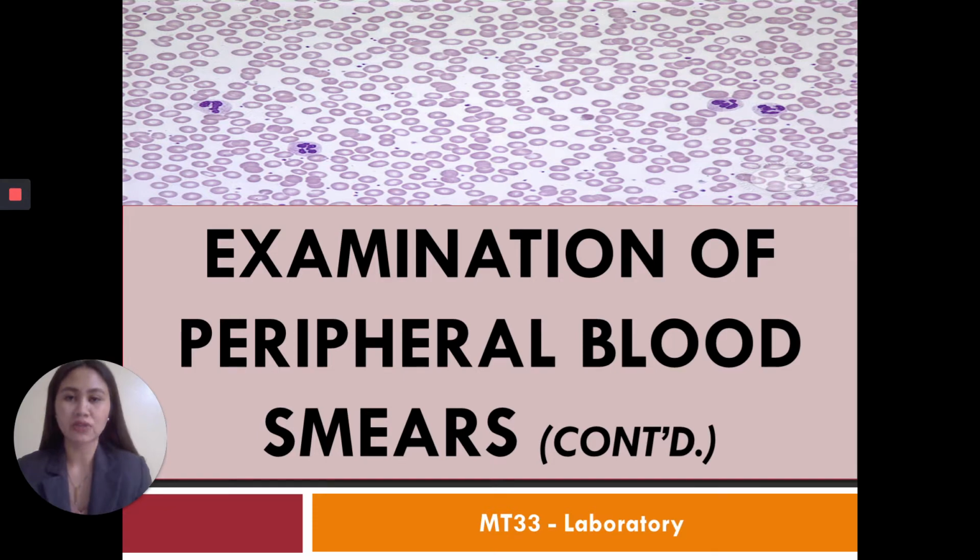But for this particular lecture discussion, I will be showing you the procedure on how to compute and view or count the different WBCs in your peripheral smear.